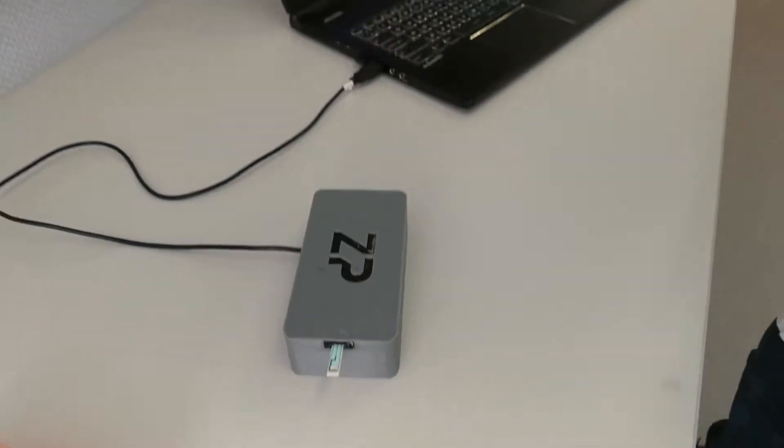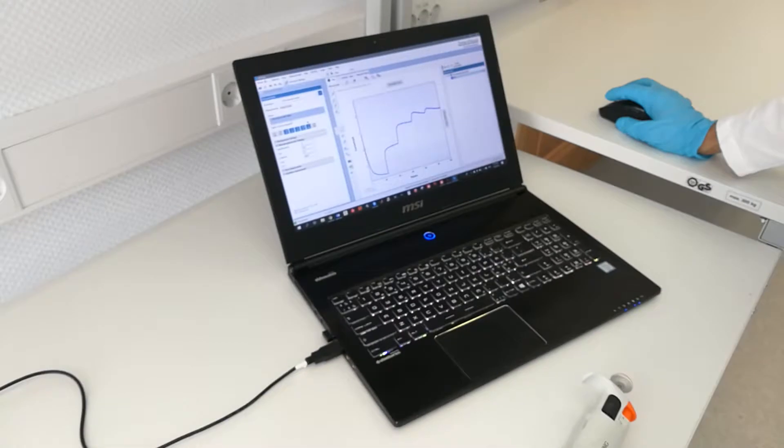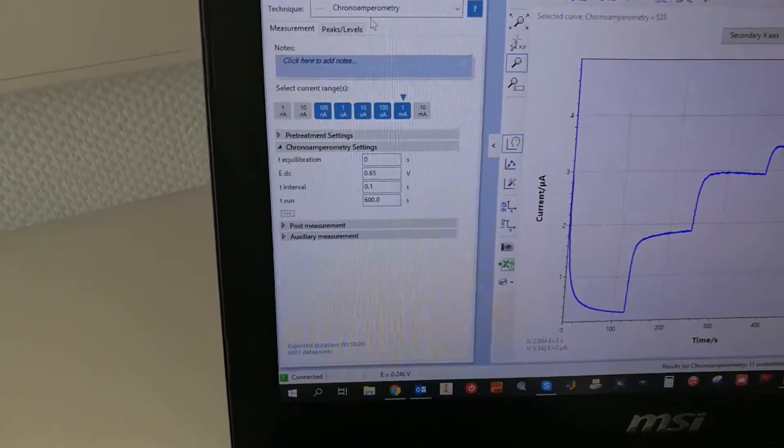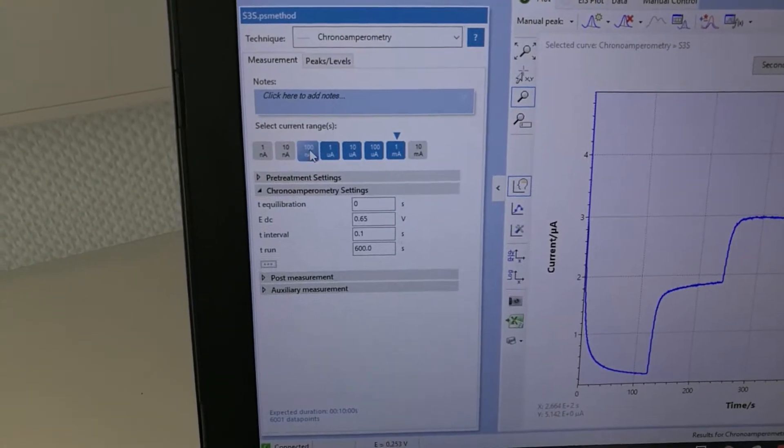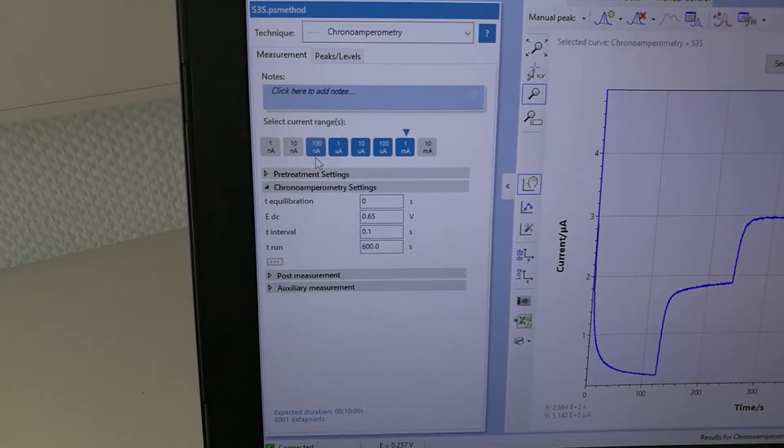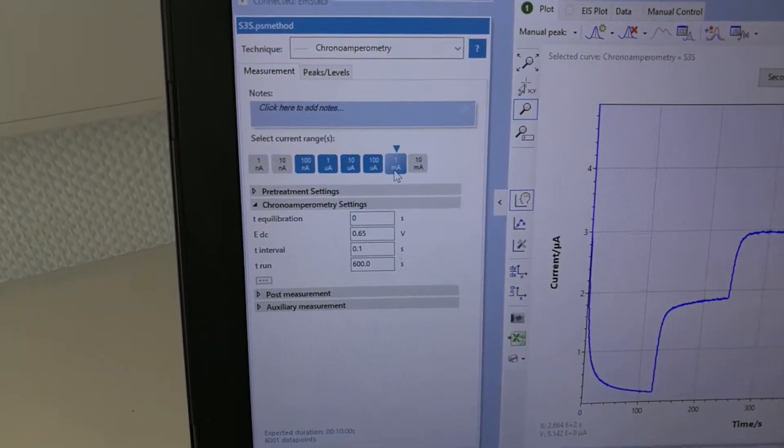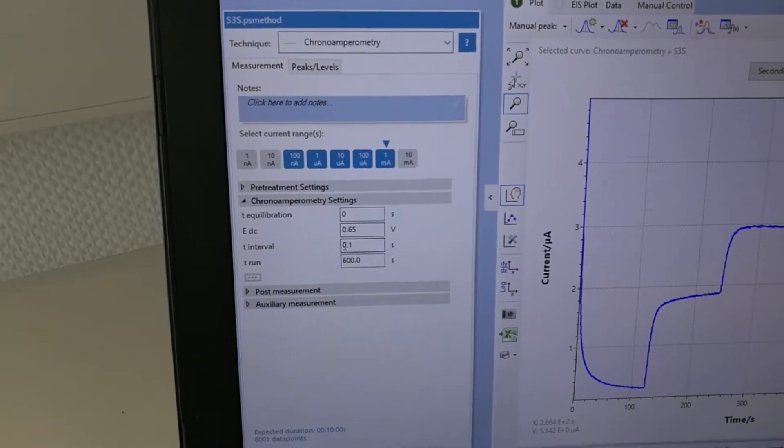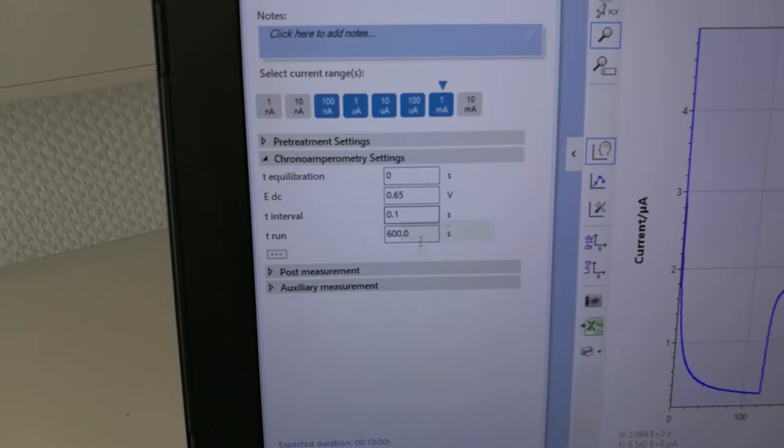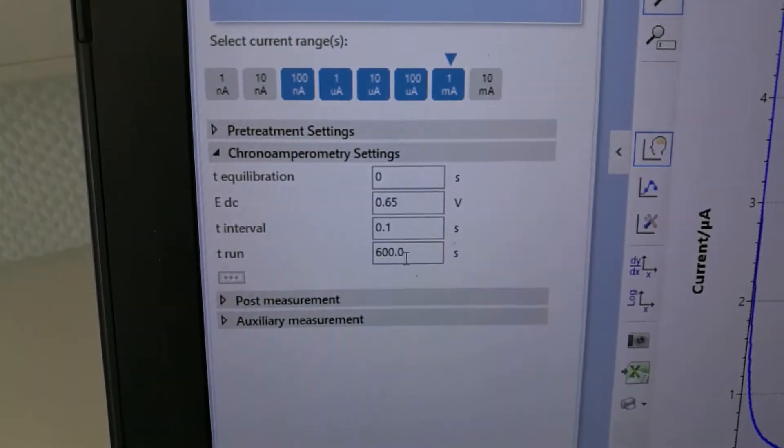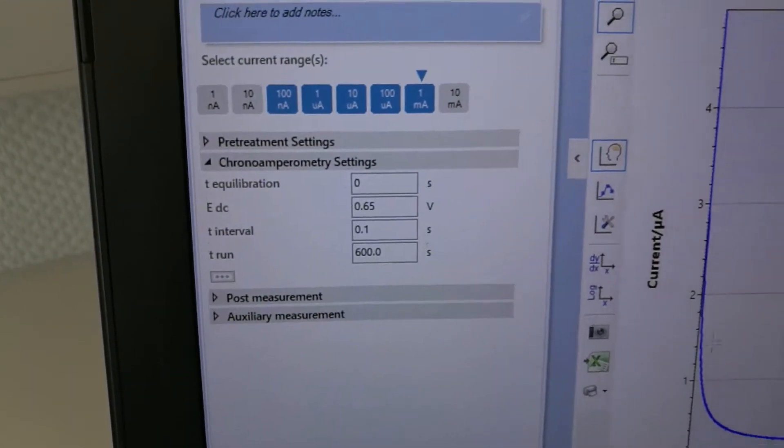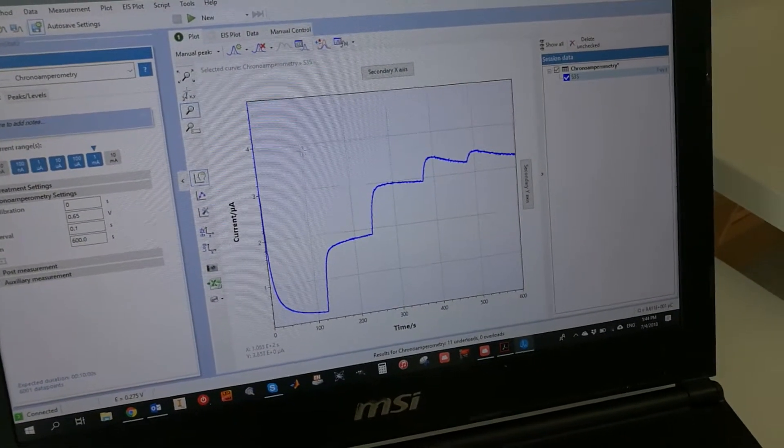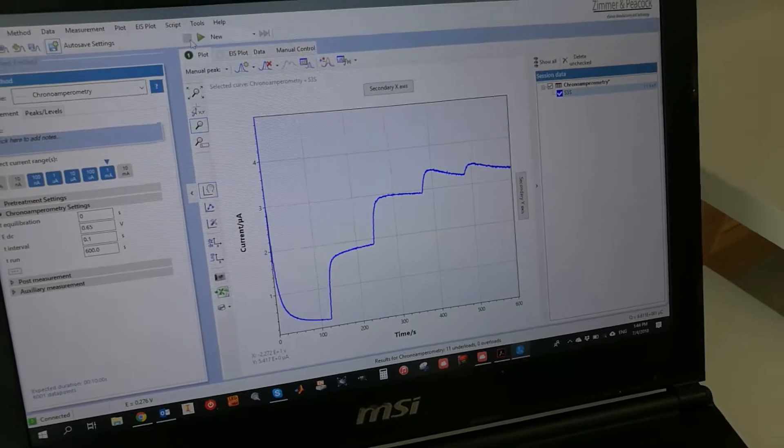Once this is done, we're going back to our software. The device is connected. We are using a technique which is chrono-amperometry. We are using a current range from 100 nanoamps to 1 milliamp with a potential applied of 650 millivolts, an interval of 0.1 seconds, and we are going to run it for 600 seconds. This curve you see to the right of those settings is a typical 5 millimolar step response to glucose of one of our sensors.